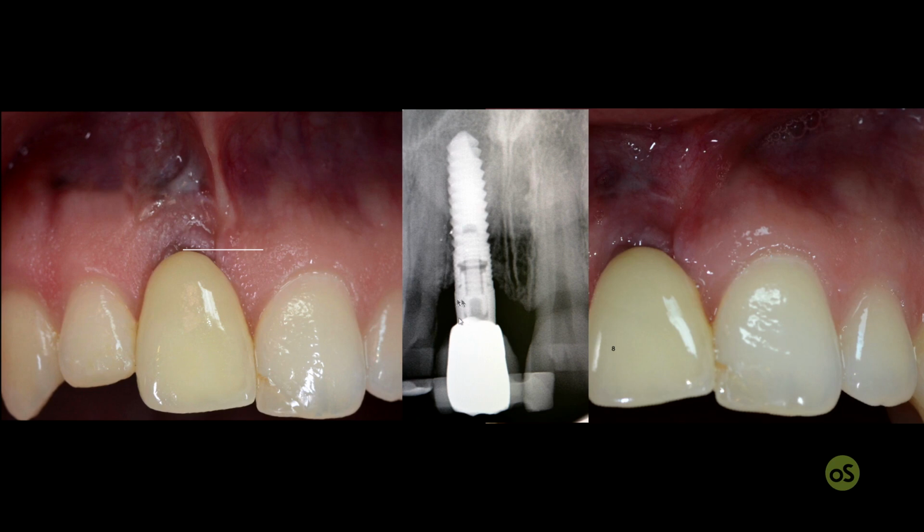The level of the bone, obviously there is some bone loss, which is due to the bad implant installation, but not for sure to perimplantitis. The whole implant surface is completely surrounded by bone. There is some obliquity of the bone crest, which is due to the implant installation, but not to perimplantitis at all.